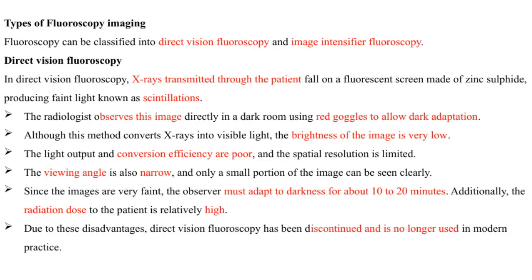Now, let's talk about the different types of fluoroscopy imaging. Fluoroscopy can be broadly classified into two categories: direct vision fluoroscopy and image intensifier fluoroscopy.